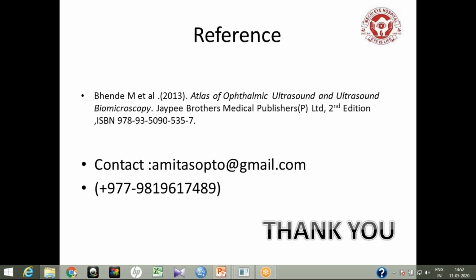But the marker will be on the nasal side. The marker is always superior in case of nasal and temporal, and in case of superior and inferior, it should be nasal.